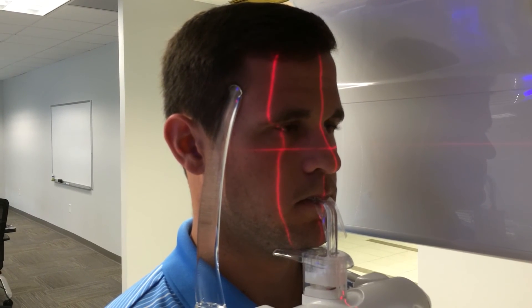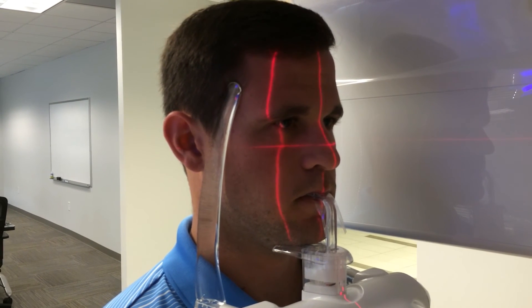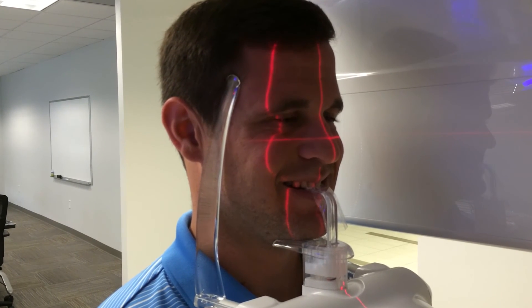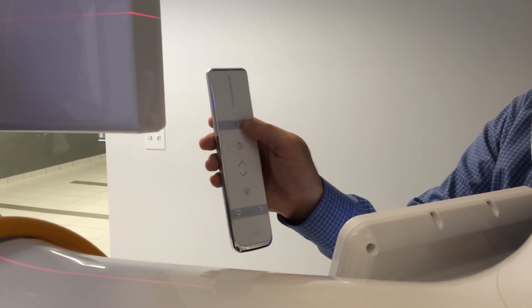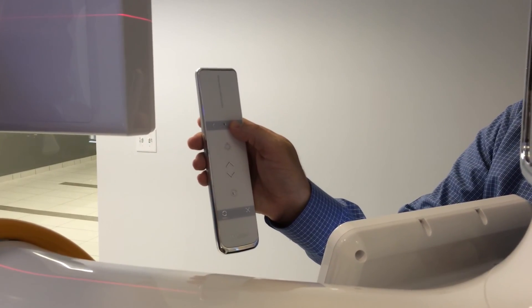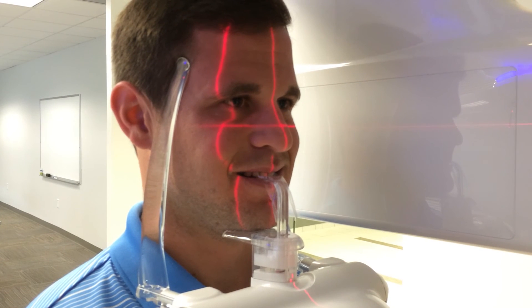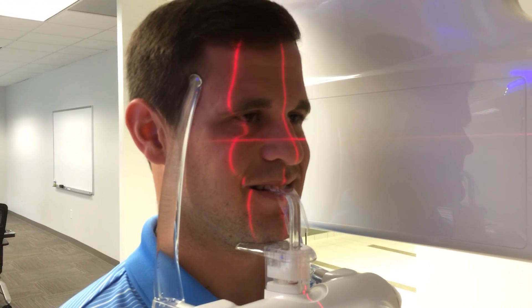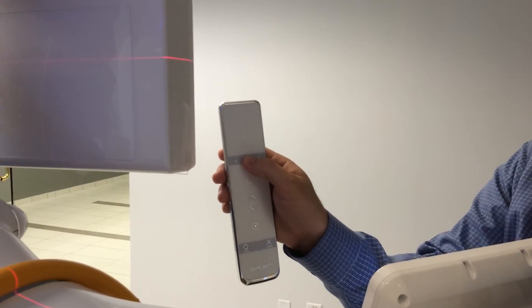Once the first two lasers are aligned, the third laser should hit the patient's right canine. JP is asked to smile so we can confirm the laser is hitting the canine correctly. If it doesn't, the remote or touchscreen can move the laser anterior or posterior as needed. Pressing the center button on the remote resets the laser position if it has been moved too far.